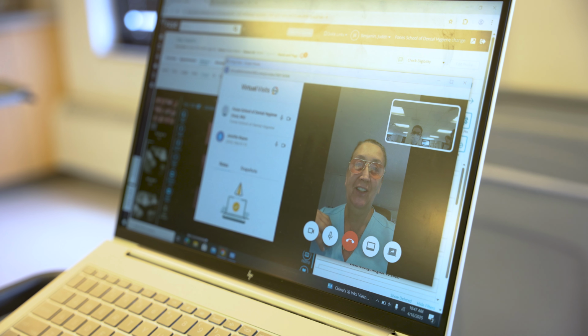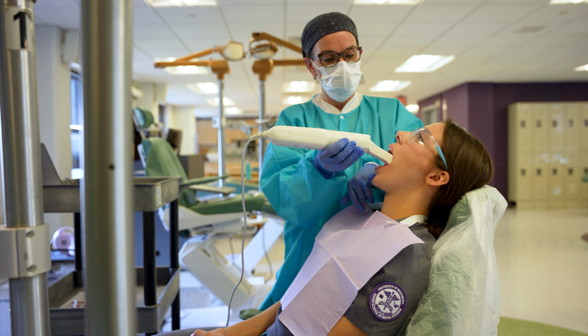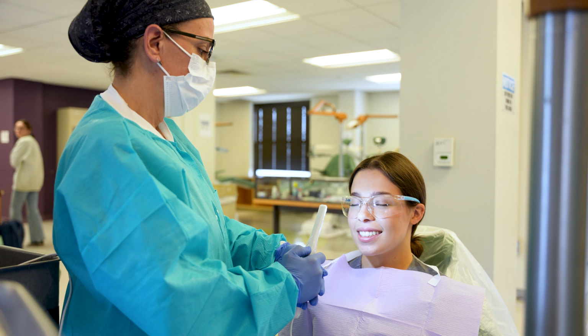Most of the equipment was supplied for us or purchased through grant funding through the Bridgeport Rescue Plan Grant. We were able to purchase a majority of the teledentistry equipment, the intraoral cameras, and the Nomad at that time, and then we've added other equipment with other grant funds.